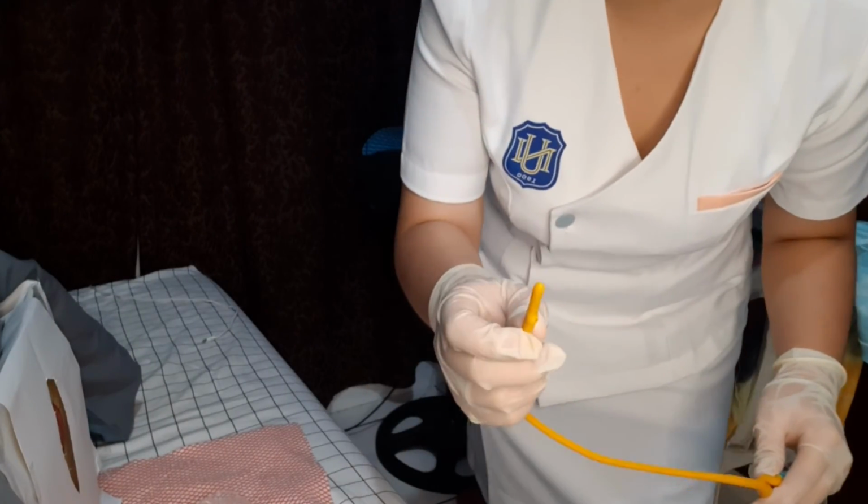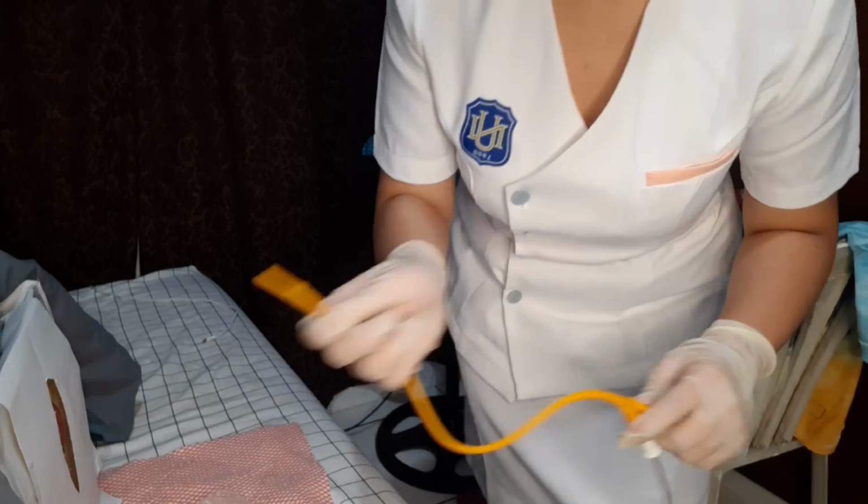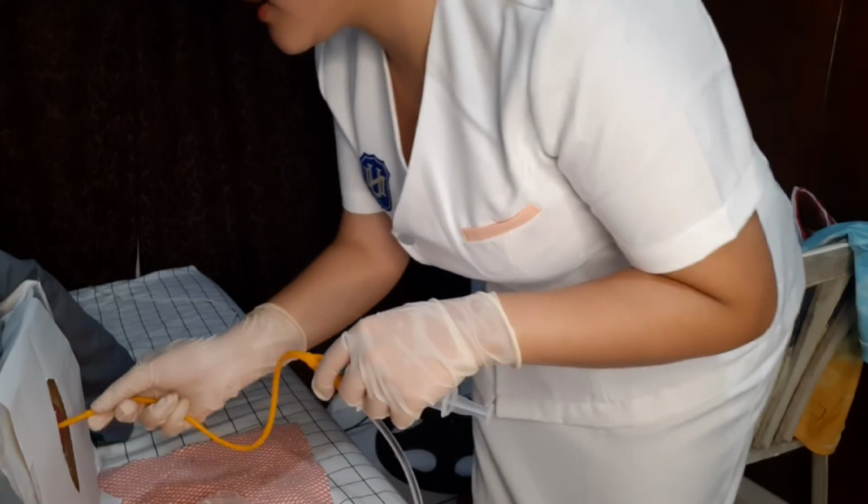So I have here the catheter, and I will put a lubricating jelly in order to be accessible to put inside the female urethra.